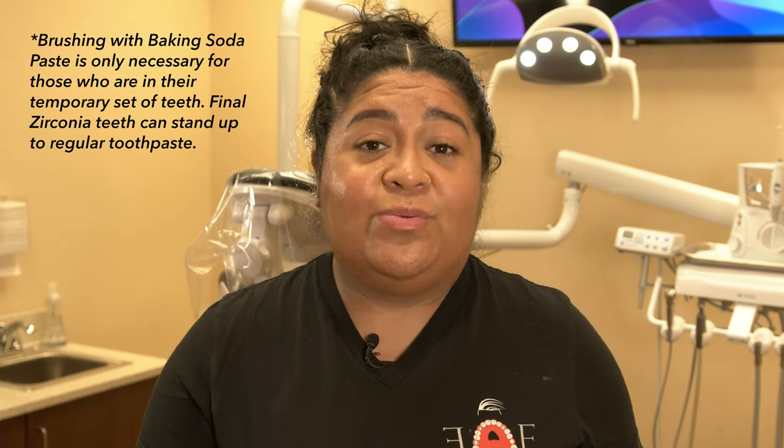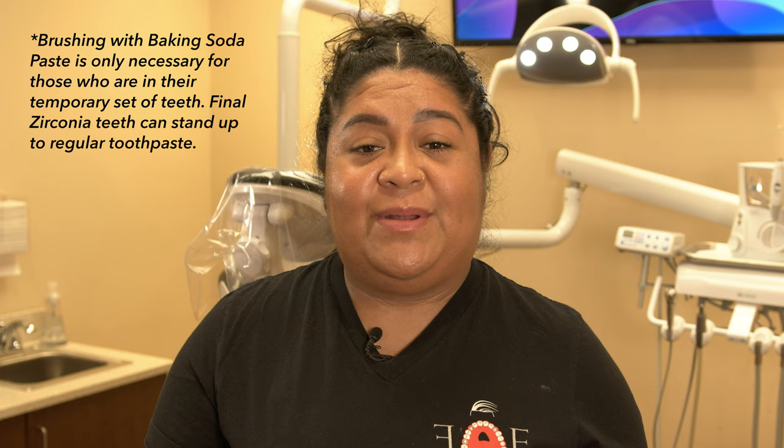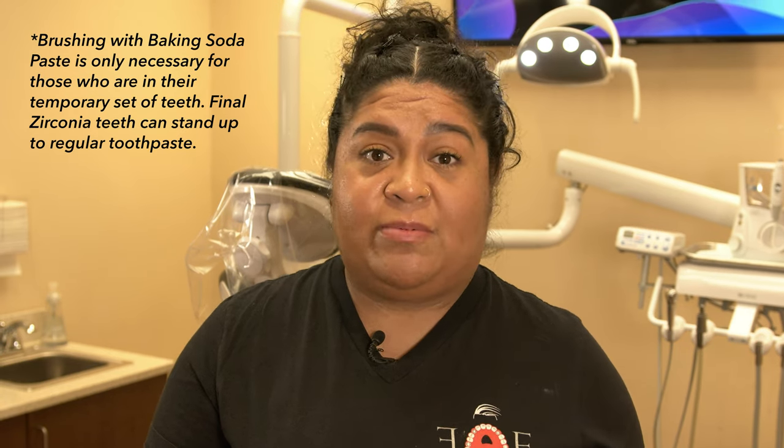After about three days, you want to start brushing very gently with a baby toothbrush — no toothpaste. You want to create a paste using baking soda and water while you have your temporaries. The reason for that is toothpaste is very abrasive; you're going to start to scratch your temporaries and notice scuff marks. When you receive your finals, that same day you will be able to go back to using normal toothpaste.